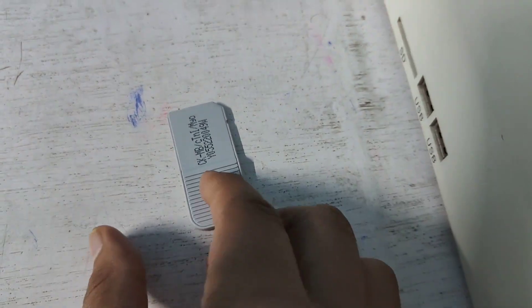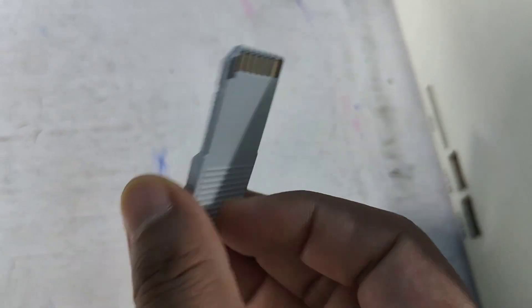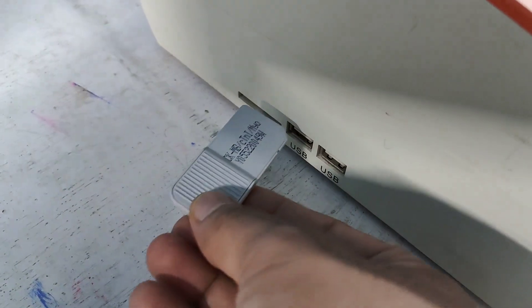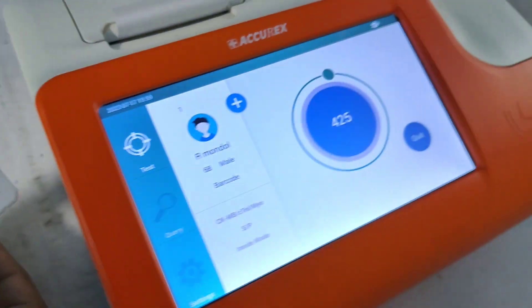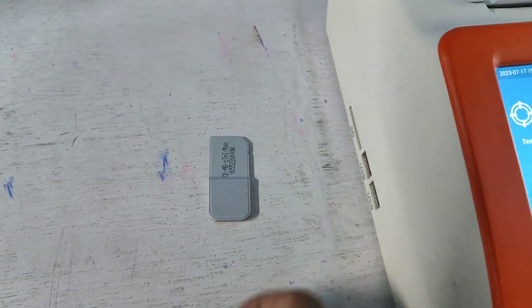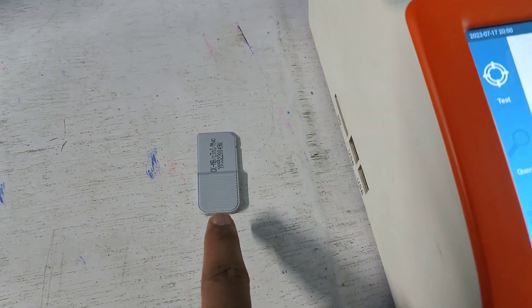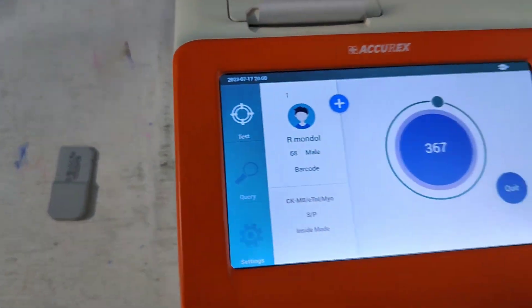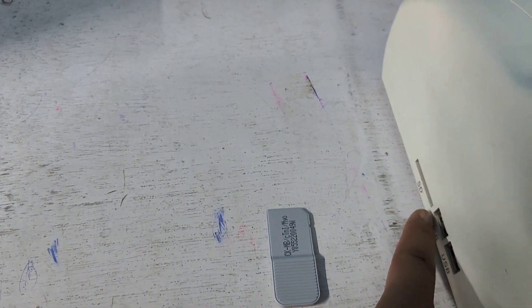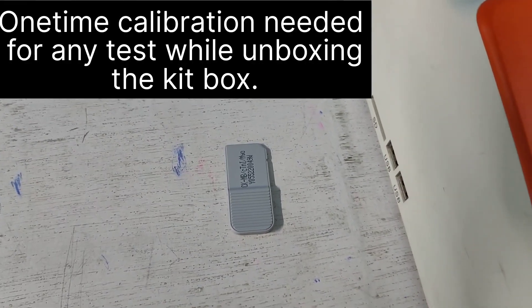Look at this — this is the chip. You can see CKMB, cardiac troponin I, and myoglobin on this chip. We have to insert it this way. As the test is running I am not going to insert it now, as I would have inserted it previously before running the test. This chip is not necessary to insert every time during the test — you only need to insert it when opening a new box, for calibration purposes.